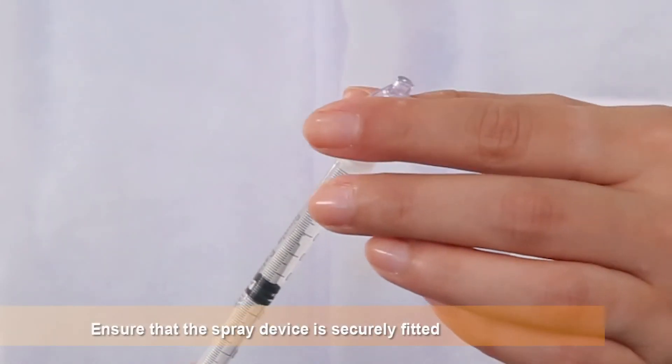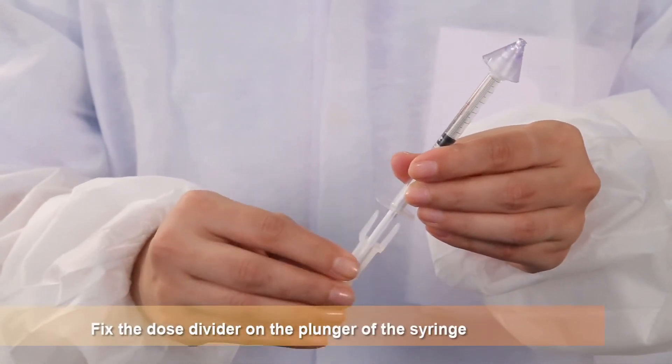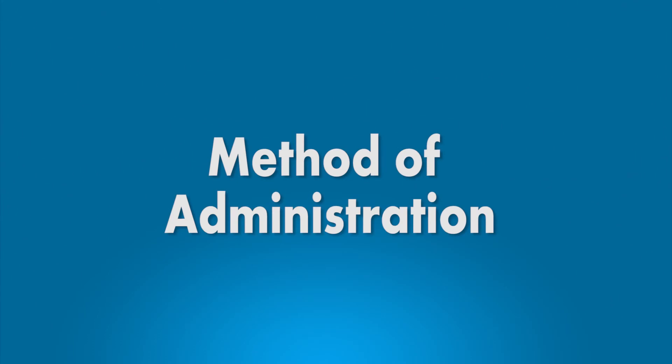Ensure that the spray device is securely fitted. Fix the dose divider on the plunger of the syringe. Method of administration.